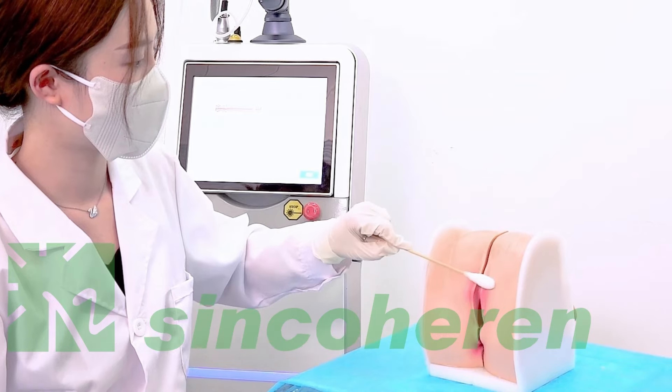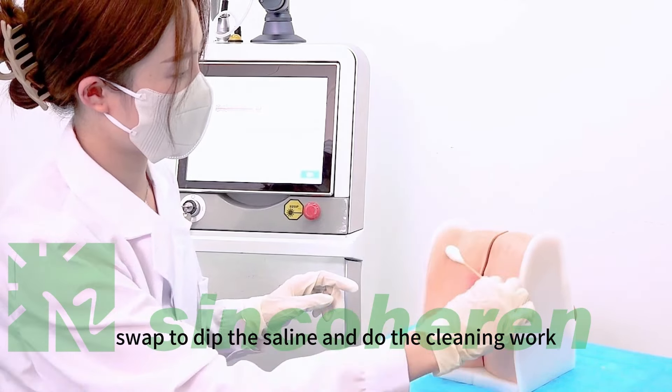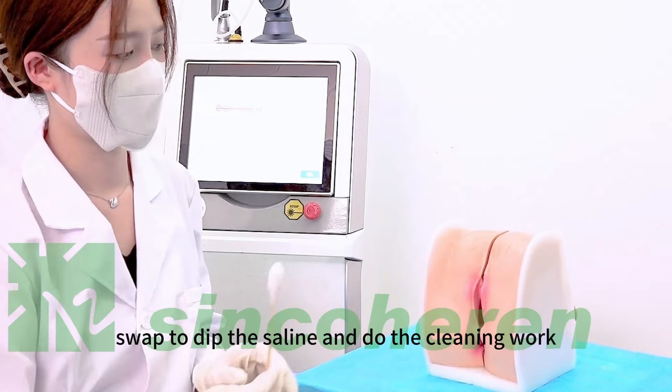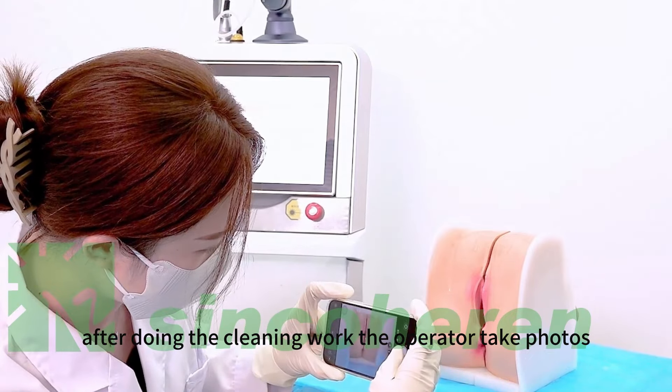Now all the hair has been shaved and we are doing the cleaning work. We use the large cotton swab dipped in saline to clean the area. After cleaning, the operator takes photos.